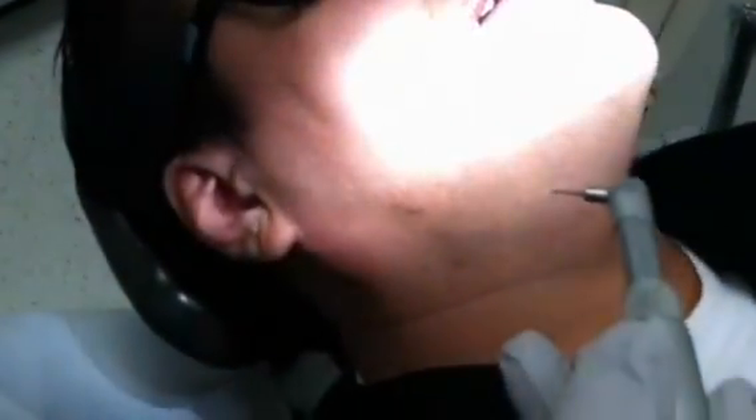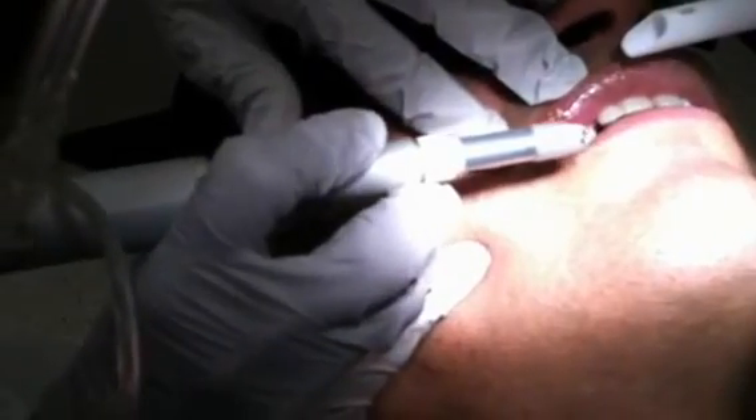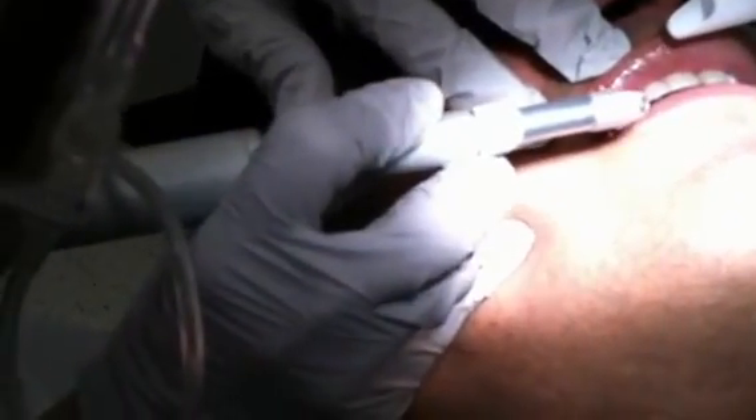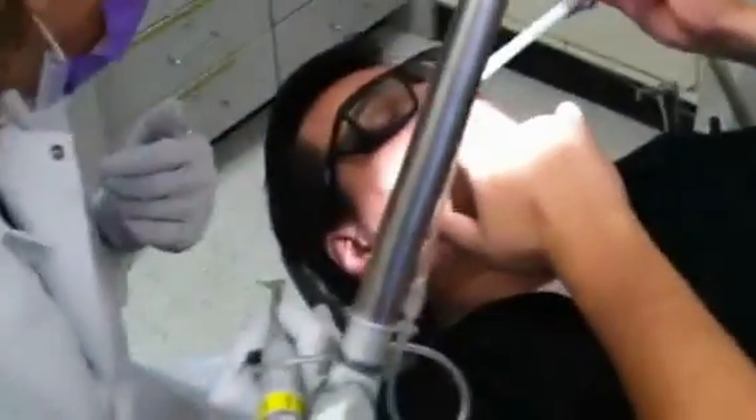Hold this, Nick, right here — can you hold that right under your nose? This is going to be a little more tender in here because you've got it right on that saw. How are you doing? Good. Now feel it with your finger — see how it feels as far as pain. You know how you get the little pain, little blisters. Is that better?